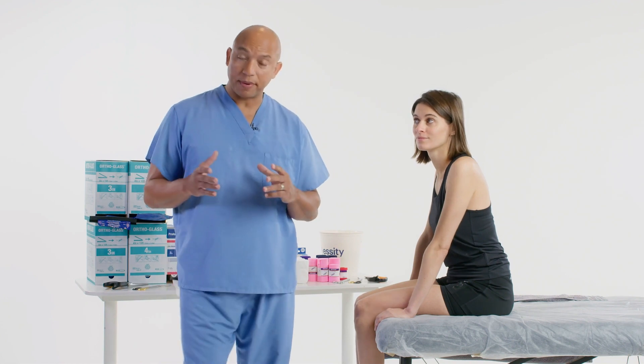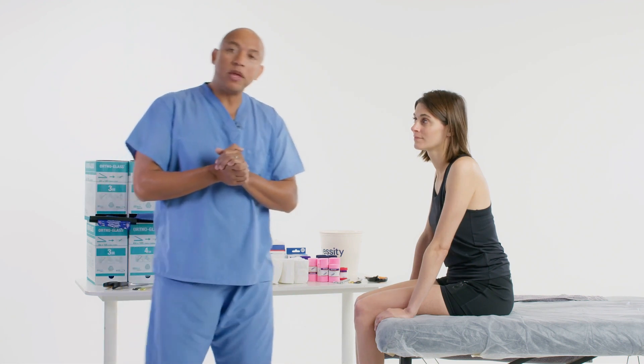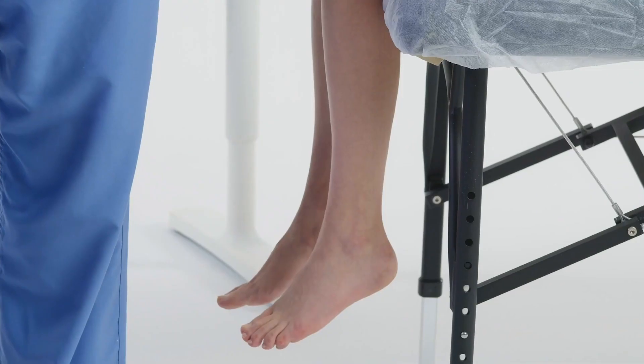Welcome to Delta Cast tutorials. Today I'll be applying a posterior splint with a medial lateral stirrup. Some people may call it an L and a U, some people may even call it just a slab on the posterior of the extremity and then a stirrup. We're going to use ortho glass, but we need to pay attention to two factors: the injury and positioning. The injury is going to be concentrated in the ankle area.